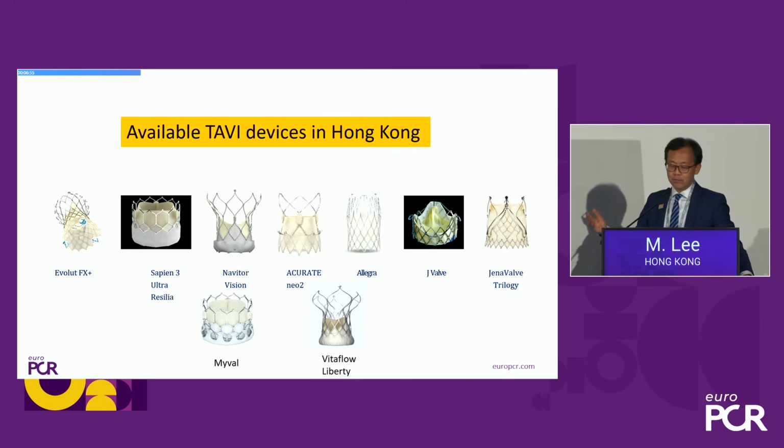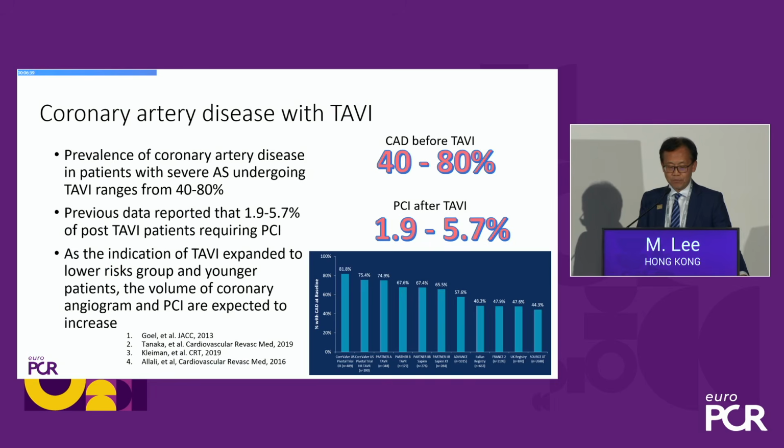These are the available devices in Hong Kong. We are using all of these devices, but when we are facing younger, lower risk patients, there are some devices which we should pay more attention to in order to achieve a better result in the future for these young patients.